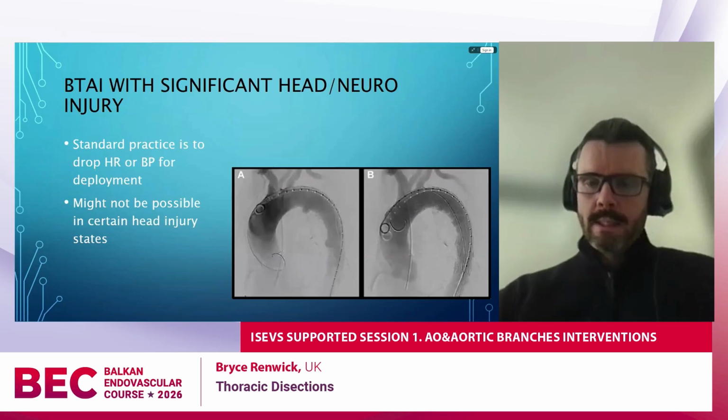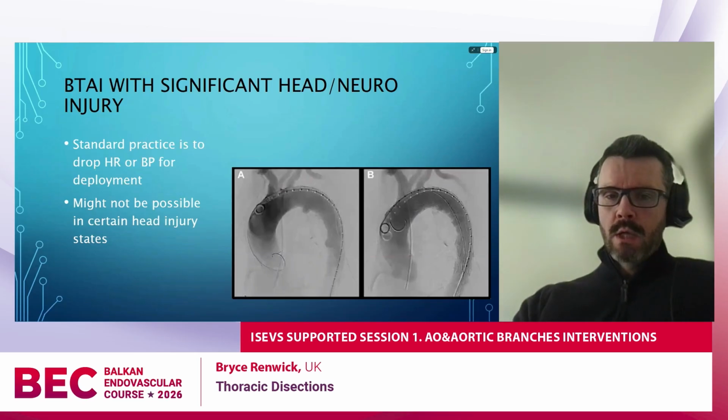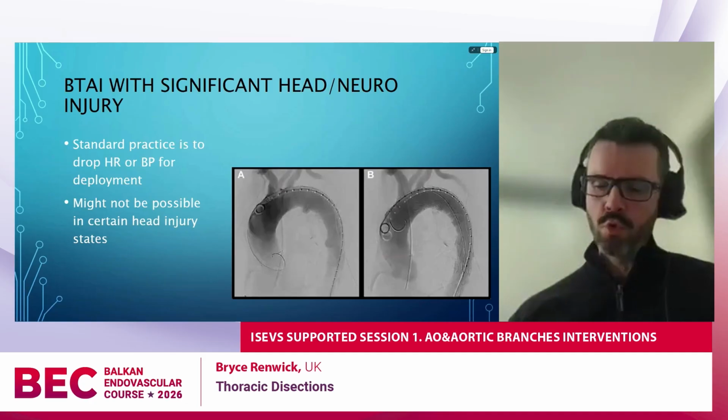The other thing is it's standard practice when deploying a thoracic stent to make the patient hypotensive or even pace the patient to achieve greater stability of the stent graft immediately prior to deployment. This might not be possible in certain head injury states because of the previously described Monroe-Kelly doctrine.